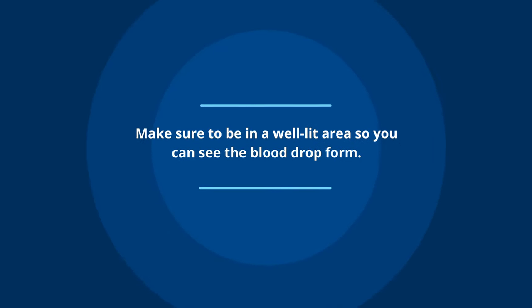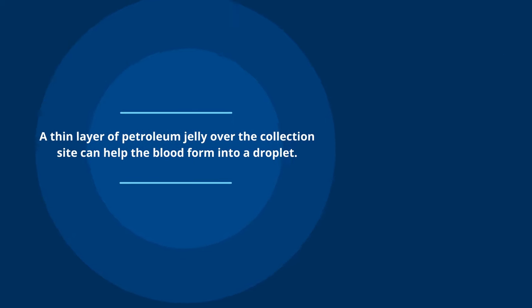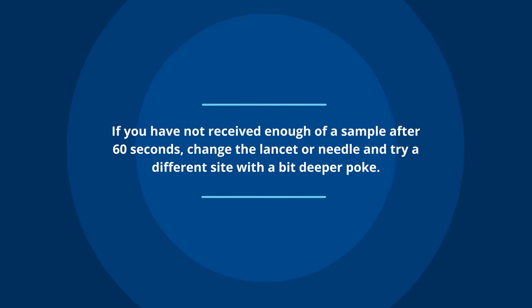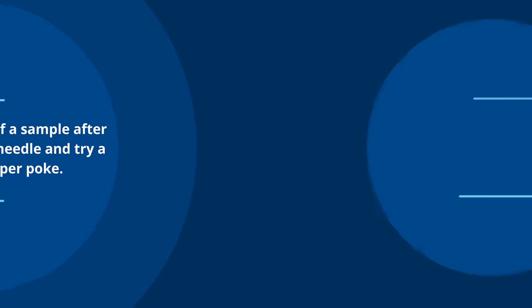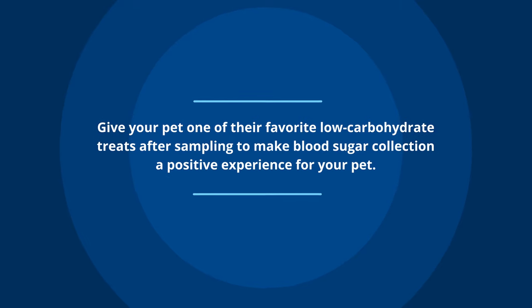Make sure to be in a well-lit area so you can see the blood drop form. A thin layer of petroleum jelly over the collection site can help the blood form into a droplet. If you have not received enough of a sample after 60 seconds, change the lancet or needle and try a different site with a bit deeper poke. Give your pet one of their favorite low-carbohydrate treats after sampling to make sure blood sugar collection is a positive experience for your pet.